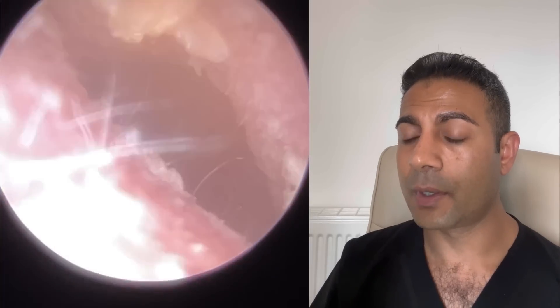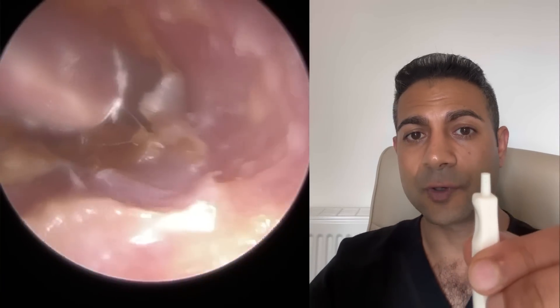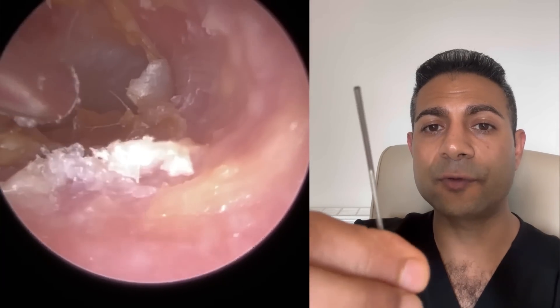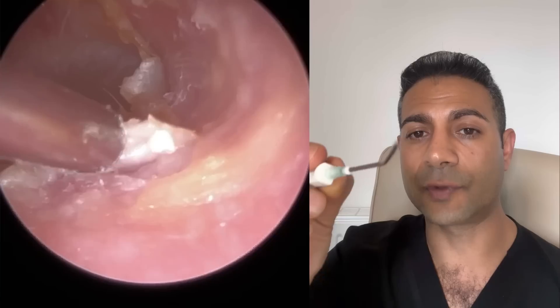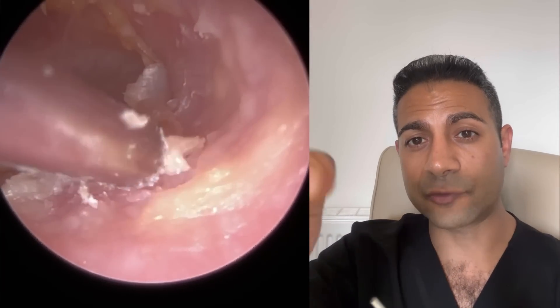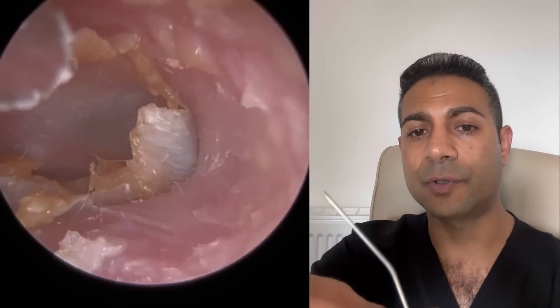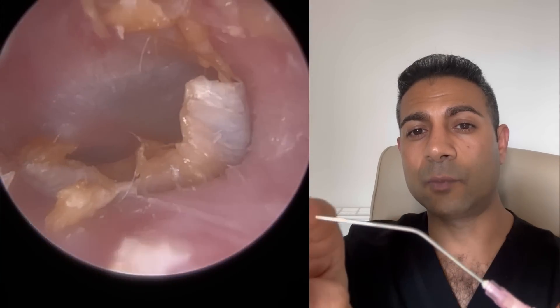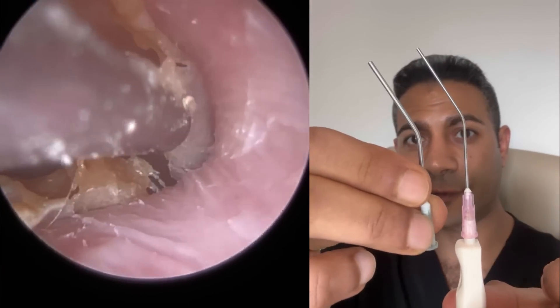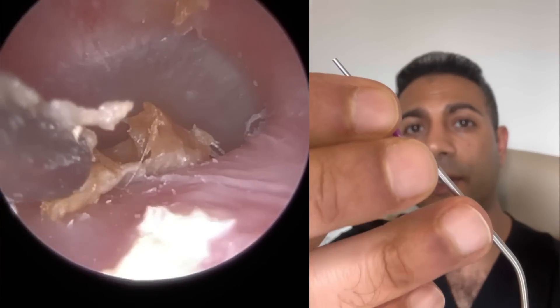So I prefer a different system — what we call a luer lock system, where you've got a handle with a male luer lock. If I want to use the zolnir suction probe, I simply attach it on and it's extremely secure. But you can also rotate it, so if you want to adjust the angulation to get better access in different parts of the ear canal, you've got that flexibility. If I then want to use a fine end, I just remove that and attach a fine end suction probe — one handle, whichever size suction tip you want. Traditionally in the UK, the normal system is a zolnir probe with a fine end attached on top.